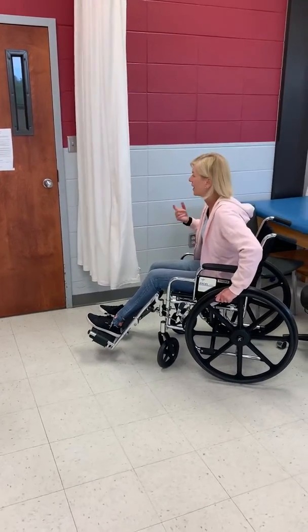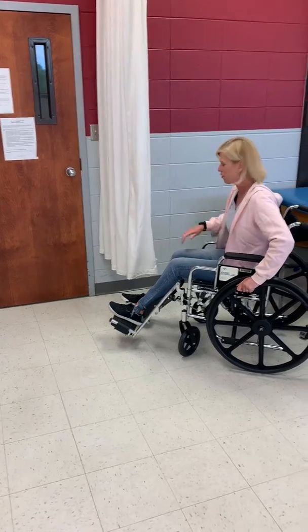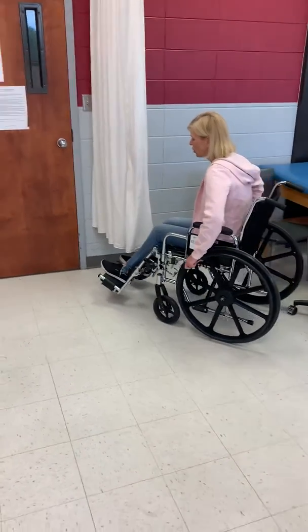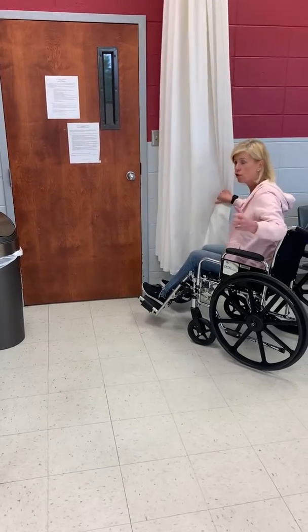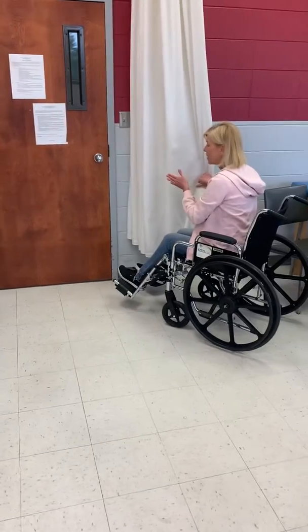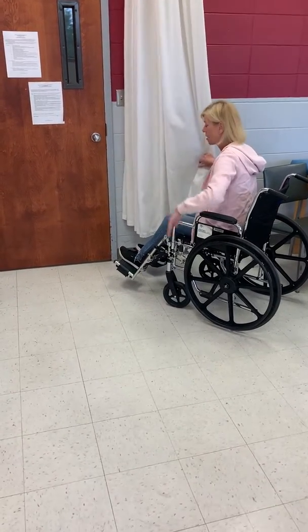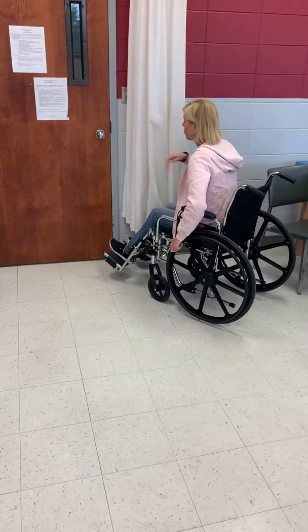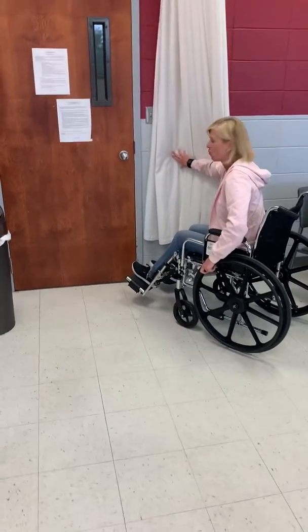I'm going to show you how to get in and out of a door that doesn't have one of those nice little automatic openers. So what you want to do is set up at about a 45-degree angle so that you don't get hit by the door when it opens up. You want to come forward and feel free to use the door frame or anything you have available in order to get out.